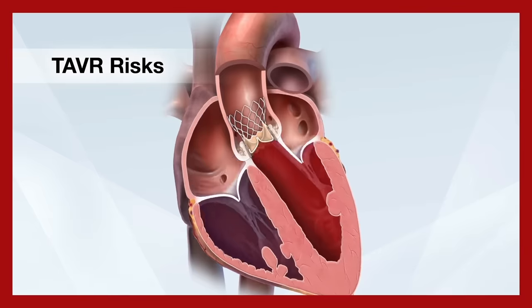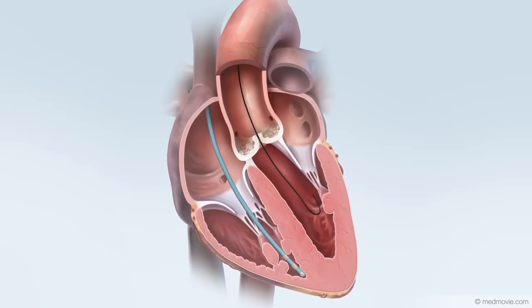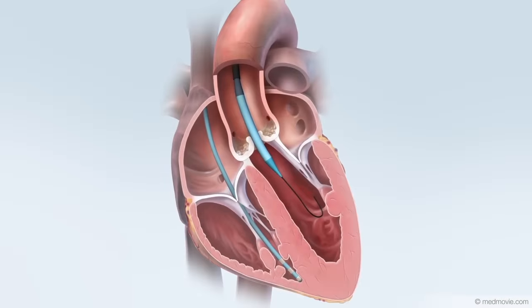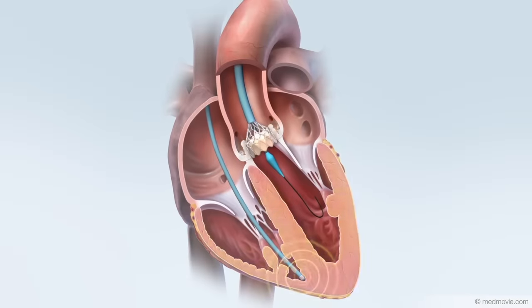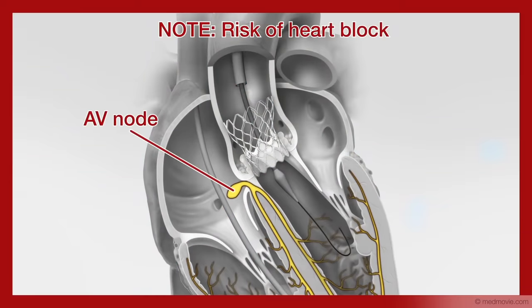Although the transcatheter aortic valve replacement, or TAVR procedure, is safe, there are some risks to be aware of. A special catheter containing a collapsed replacement valve is inserted. Note that the openings to the coronary arteries are close to this area, and blocking these openings is a risk. Once the new valve is positioned correctly, the heart is paced. Note that the heart's electrical system is close to this area, and interfering with normal beating of the heart is a risk.